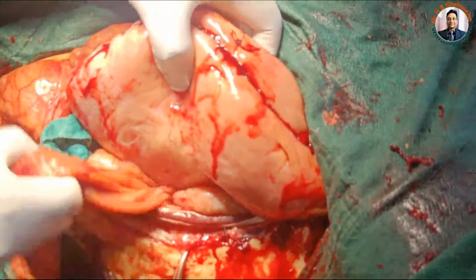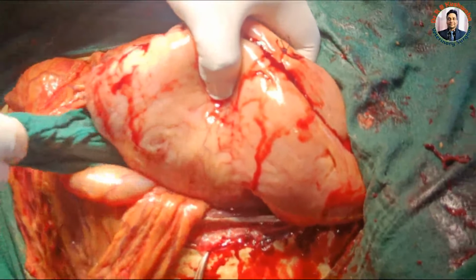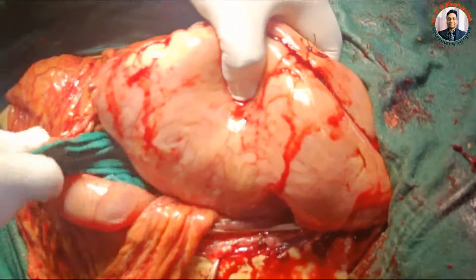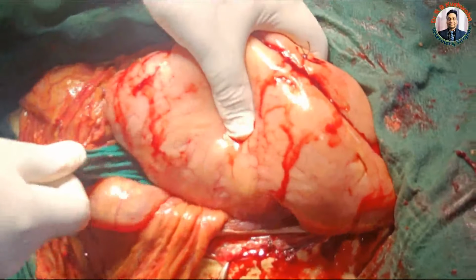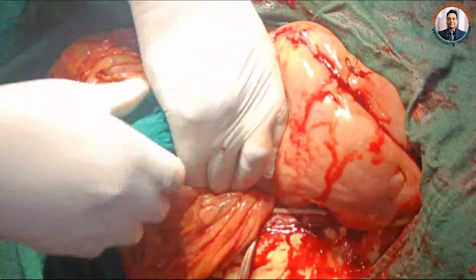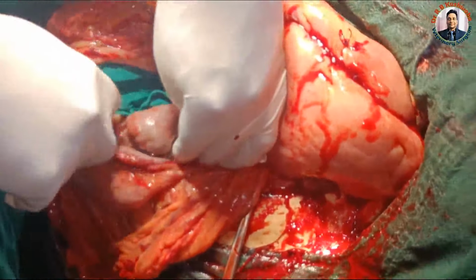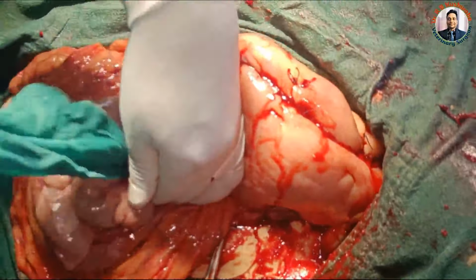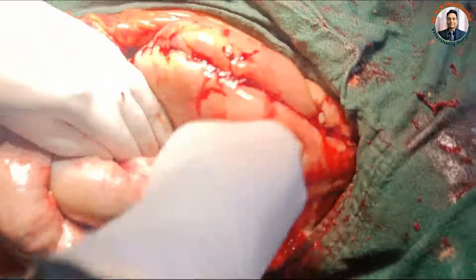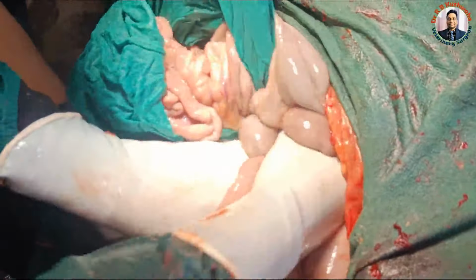So this is very important to prevent the leakage of the uterine content, because we never know unless and until you open the uterus. So just to prevent any type of uterine content going inside the peritoneal cavity, we should properly drape this. So this one is the 2. So this is the 3rd one.